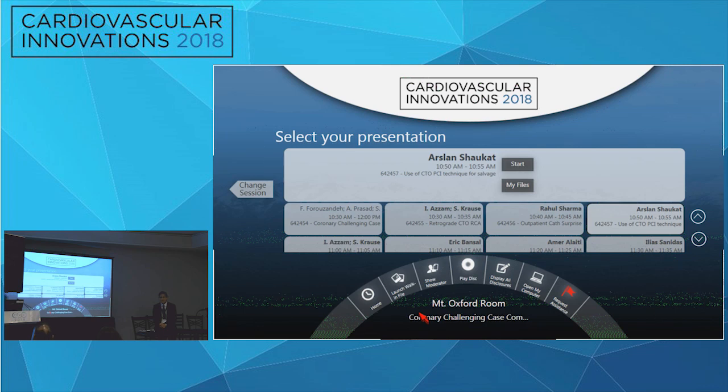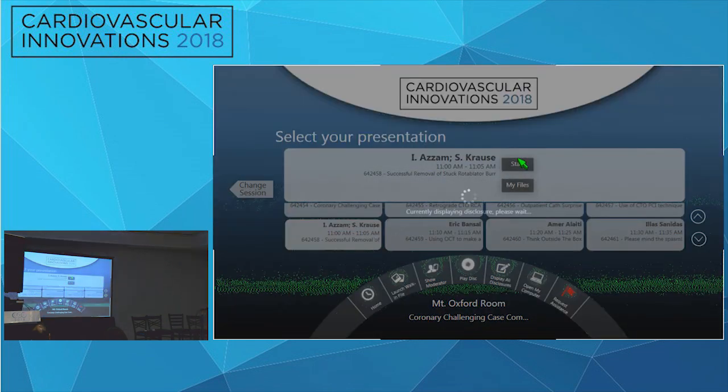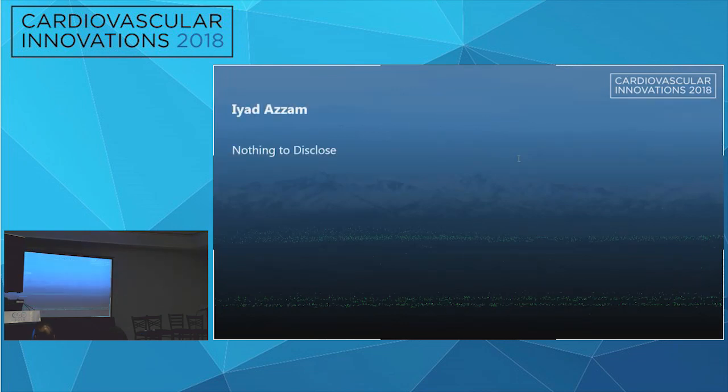Very good. Yeah, please. Next case will be Dr. Azzam again, is that correct? Successful removal of stuck Rotablator burr. Thanks again. Nothing to disclose here.